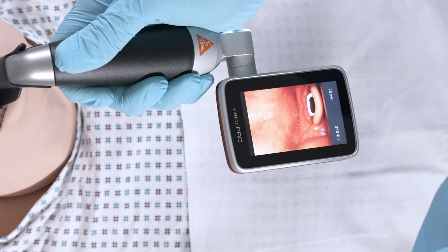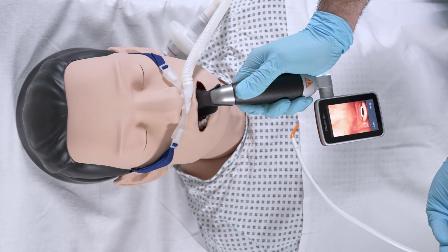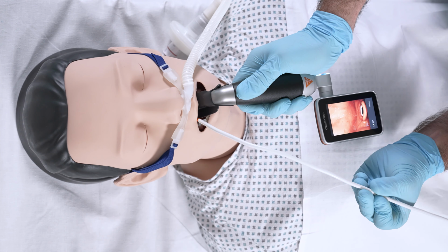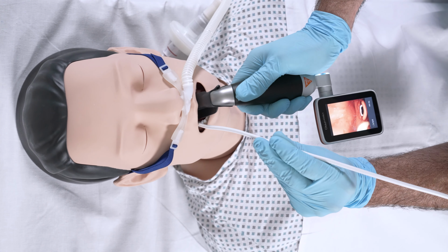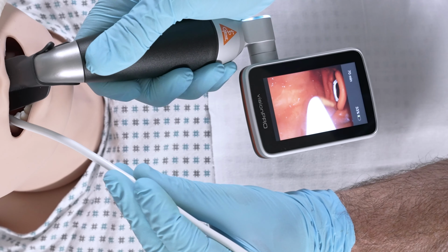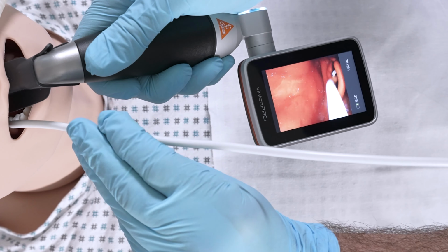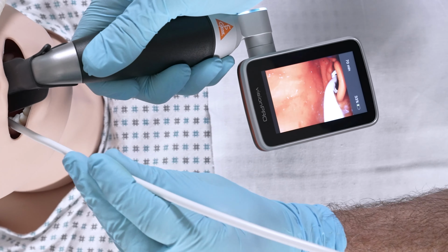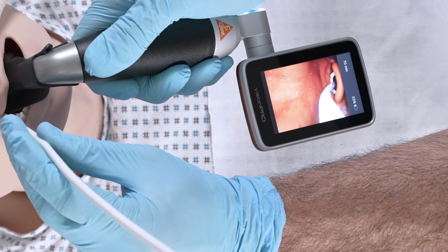And then my assistant can give me a bougie. It's also very practical to use a bougie. And we intubate the glottis with the bougie. You can see it on the screen, and this takes a bit of eye-hand coordination. And we put it in the glottis. You can see it clearly. And the patient may cough a little bit because he's awake.